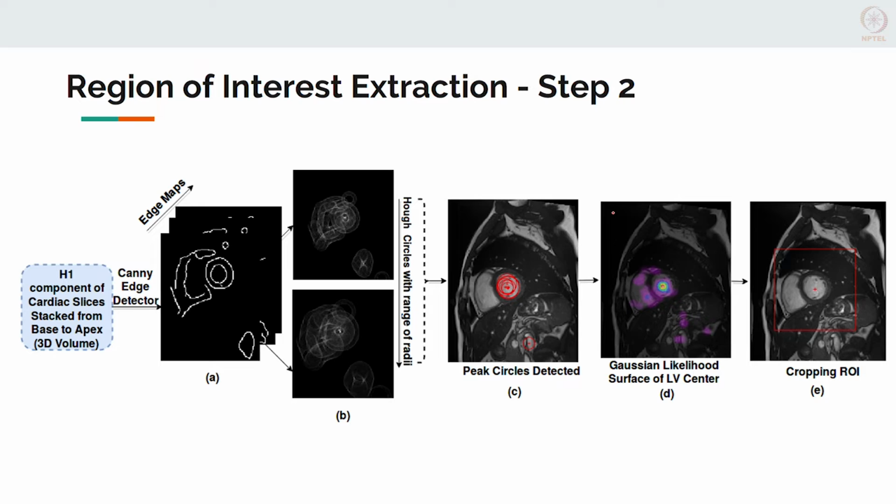So, once we have that, then we can do an edge detector on the standard deviation image. We use a standard Canny edge detector. If you do not know what a Canny edge detector is, you can search online, there is a lot of literature on the subject. MATLAB has a Canny edge detector inbuilt. So, you can just look for that in the help and try it on some standard images that are provided.